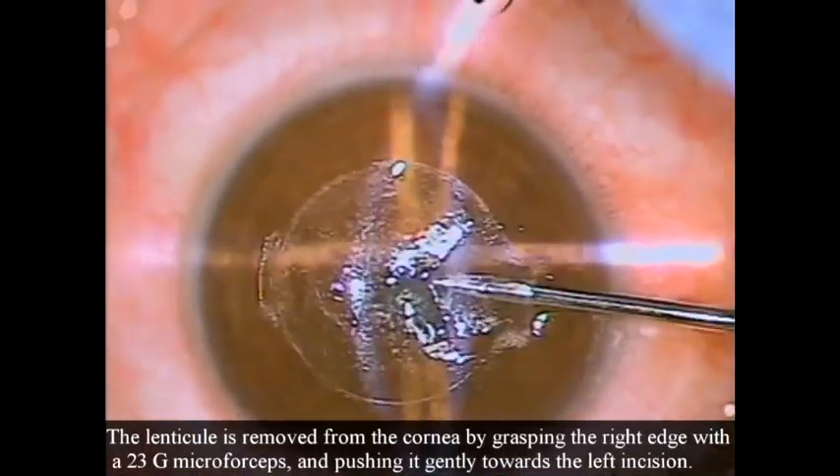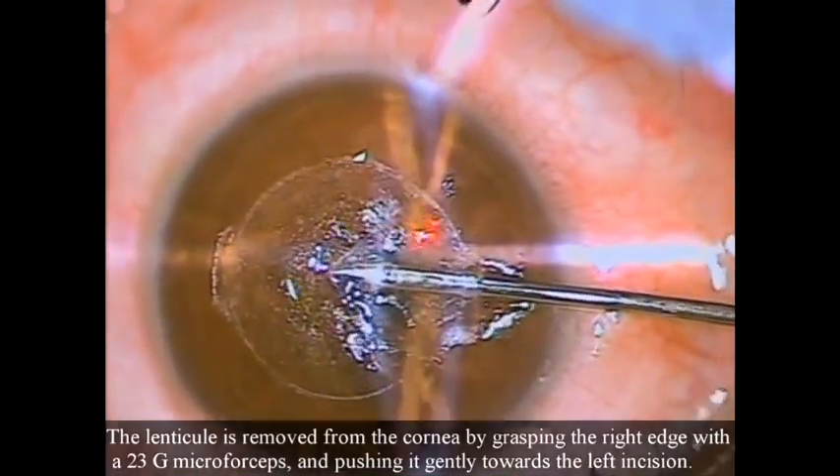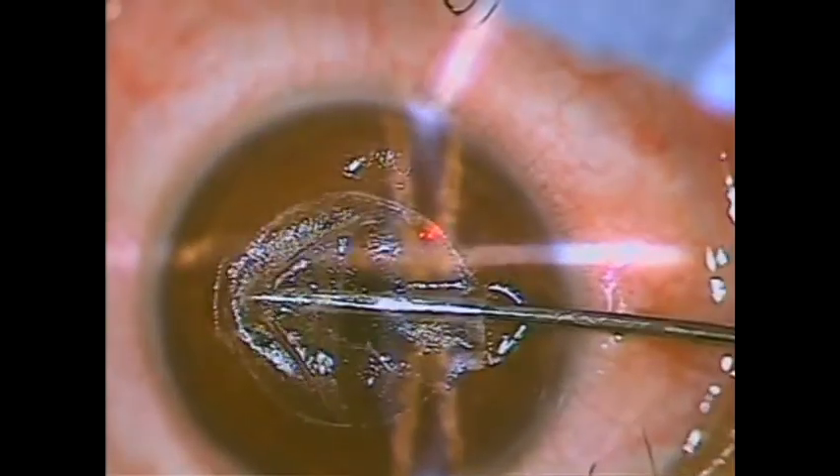The lenticle is removed from the cornea by grasping the right edge with a 23-gauge micro forceps and pushing it gently towards the left incision.